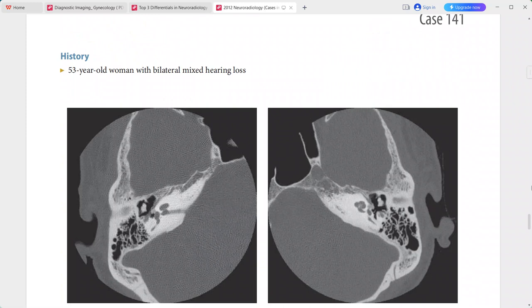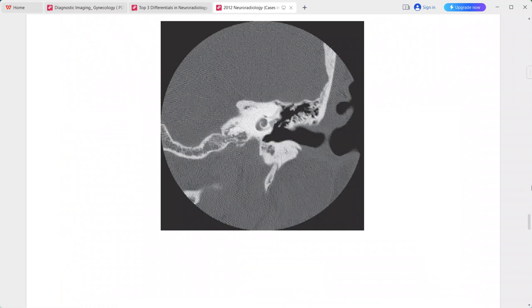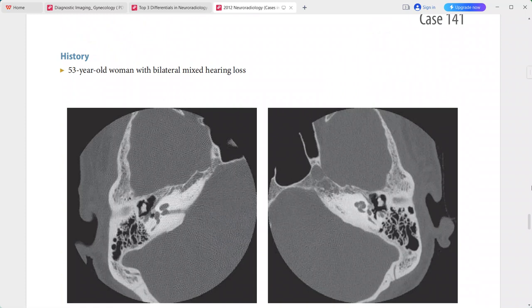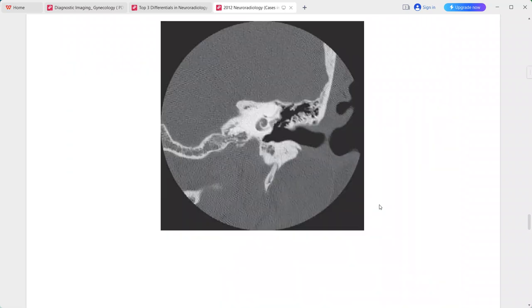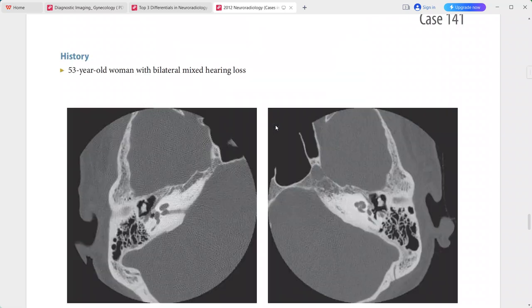A 53-year-old woman with bilateral mixed hearing loss. There is a focal area of demineralization immediately anterior to the oval window bilaterally, consistent with an otosclerotic focus. The magnified view highlights the focal nature of this bone demineralization. This is a case of fenestral otosclerosis. Differentials include focal demineralization due to sarcoid, syphilis, or tympanosclerosis.